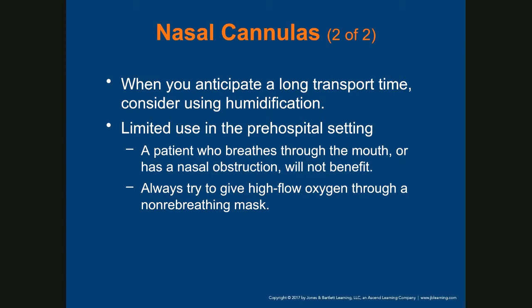All right, now when you anticipate a long transport time, consider using humidification, right? And that's a little container device that is attached to the regulator, and it has water inside of it, sterile water, right? Don't fill the humidifier up to maximum, because you will start to get water into the line. Keep it at minimum, right?